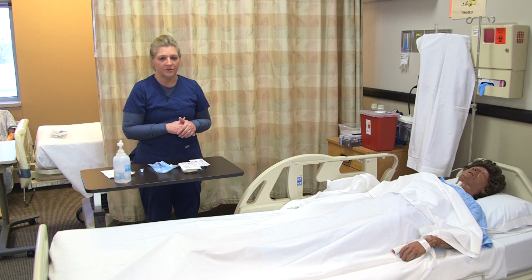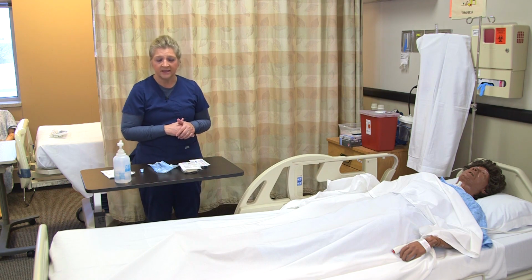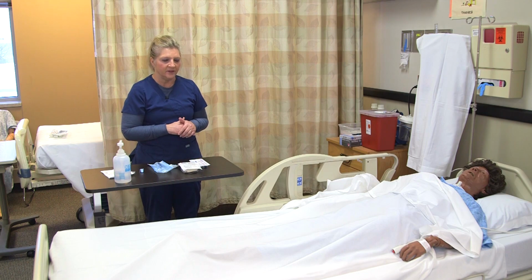And in this case, the order is for an IV saline lock that we're going to place. And it's for giving IV antibiotics and other medications. The patient is not going to have infusing IV fluids at this time.